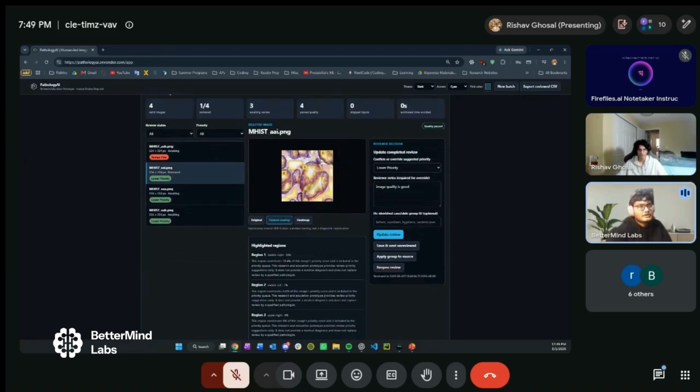Look, I just have one thing. I'm just curious about one part over here. The main model that you're using, that's on Hugging Face, right?